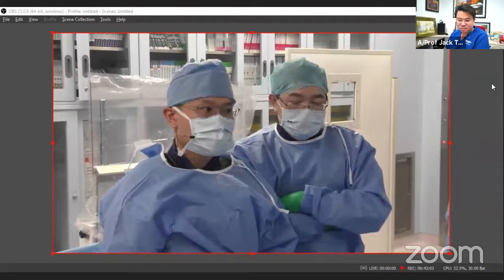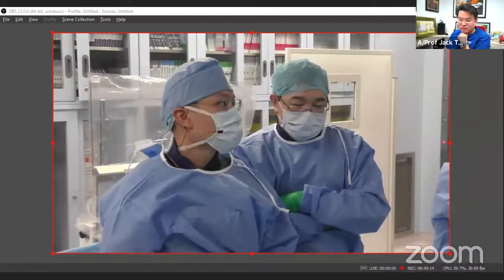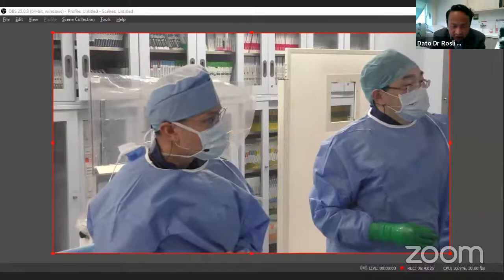Do you find any difference in just covering to the left main ostium and therefore having more flexibility in the POT and post-dilatation? Rosli, is that your practice? If the left main is relatively normal, do you need to stent to the ostium necessarily? I don't think it's necessary, but you just need to ensure that you've got enough length for the POT, because you don't want to land it a bit outside the stent struts.